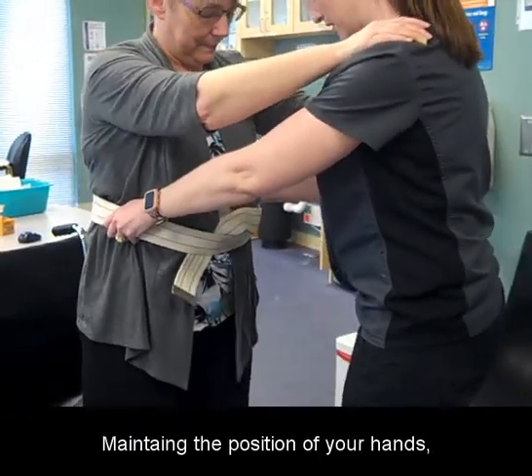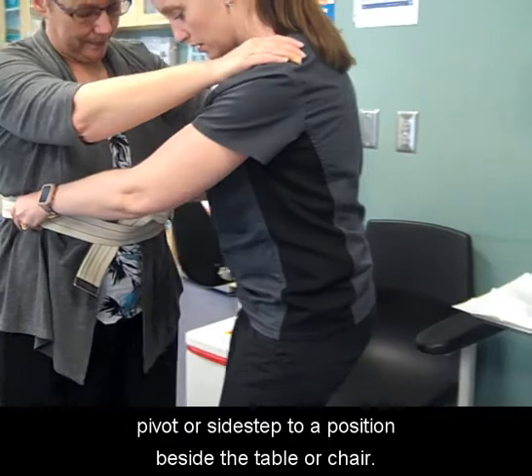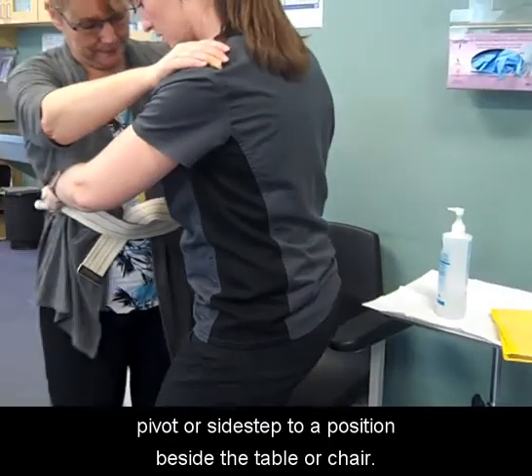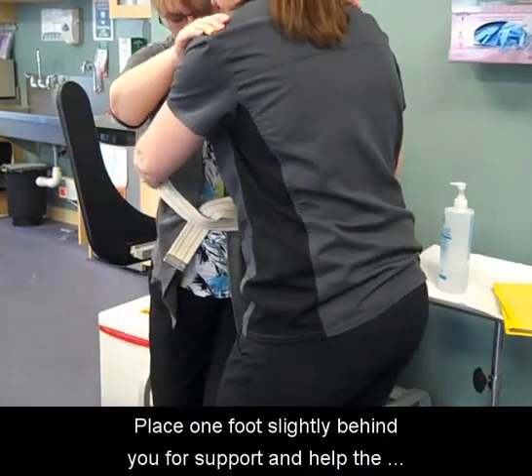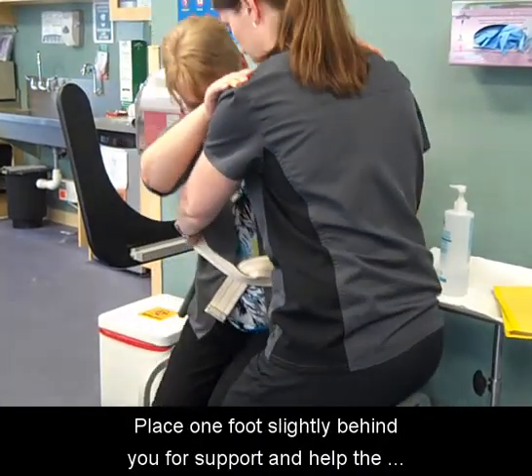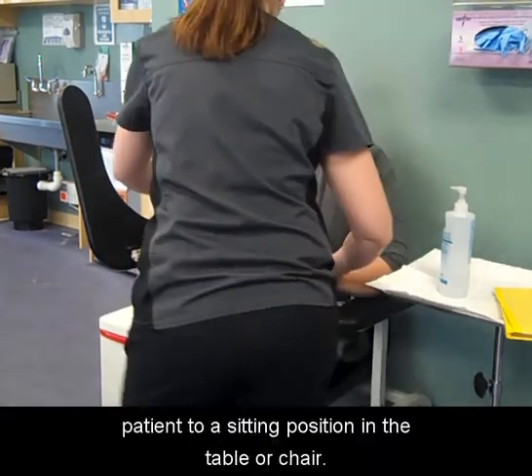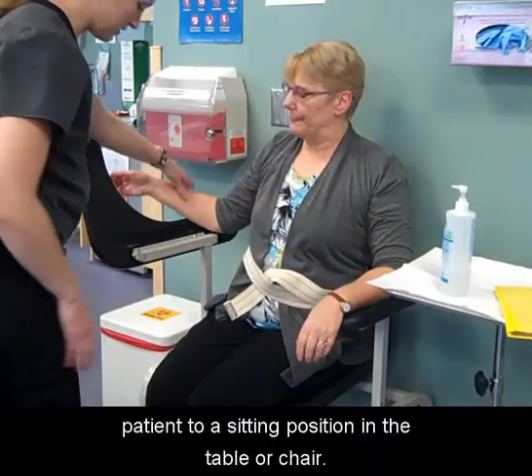Maintaining the position of your hands, pivot or sidestep to a position beside the table or chair. Place one foot slightly behind you for support and help the patient to a sitting position in the table or chair.